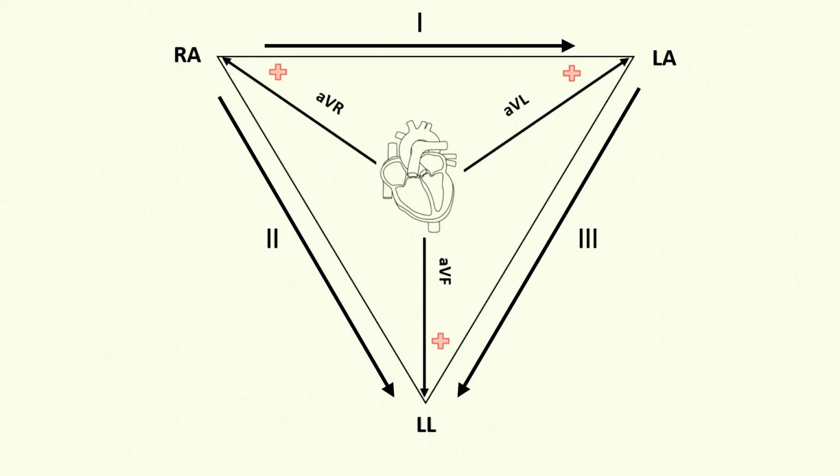And that's why if you have a reversal between the right leg and the left leg, you would never know that on ECG because they look identical. The both of them are looking up at the heart, and the right leg sees the heart right over there, and the left leg sees the heart right over there, but they look pretty much the same. So you can, for convenience, put the electrodes actually on the torso closest to where the designated limb would have been. Very good question.